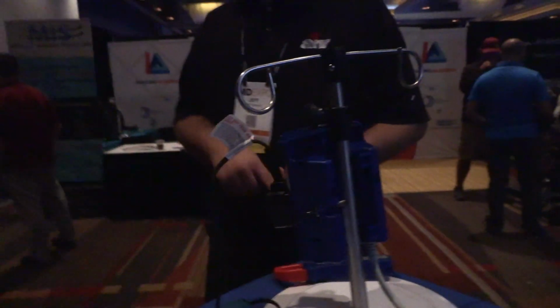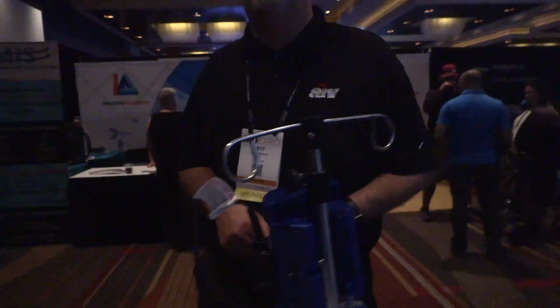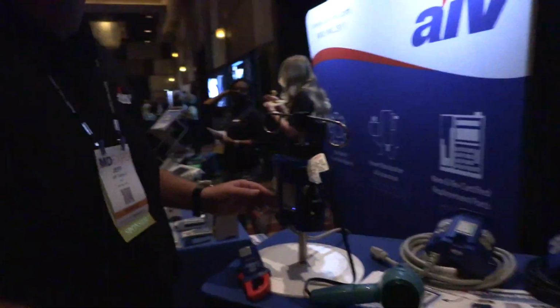Right. This also carries the 60601 rating, so it's a standalone medical device. So we're trying to accommodate all of the inspectors, for interpretation. Dual breakers on it. It has Hubbell receptacles. Nice. So we upgraded to the Hubbells.